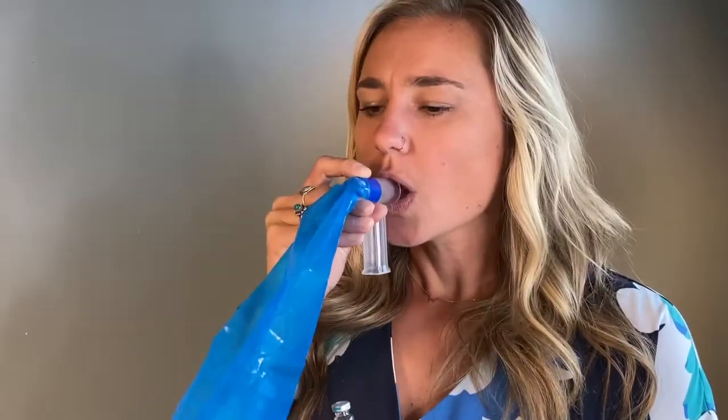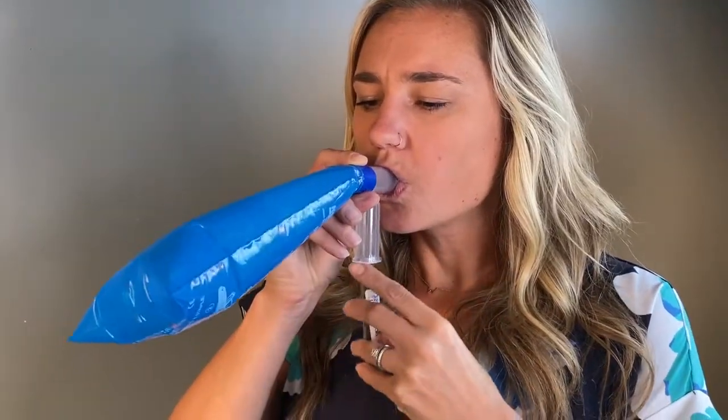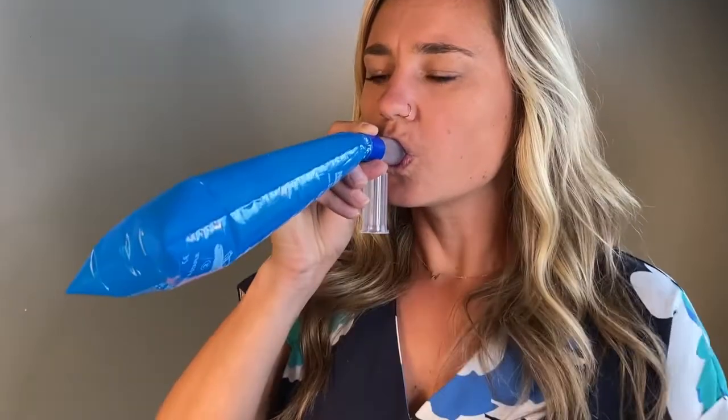Breathe in normally, then hold your breath for five seconds. Exhale continuously into the bag to fill it with air, then press the tube into the device and hold for two seconds. Remove the tube before you stop exhaling.